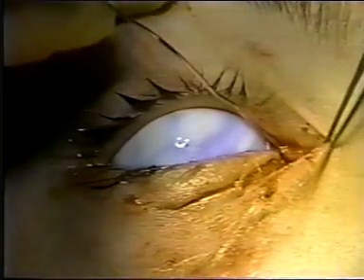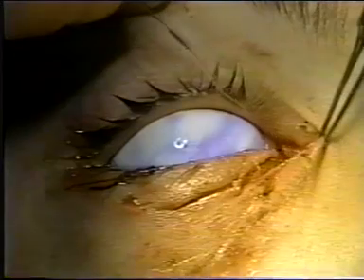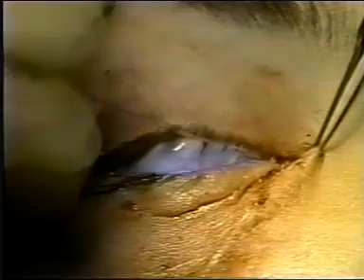The Bowman probe can be inserted into the cut end and gently manipulated into the lacrimal sac.